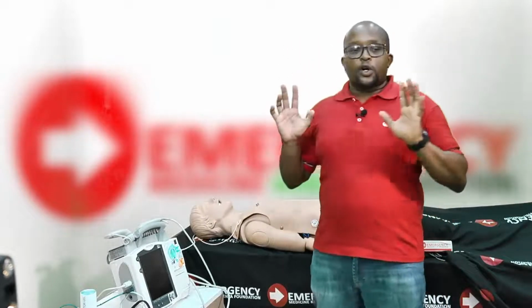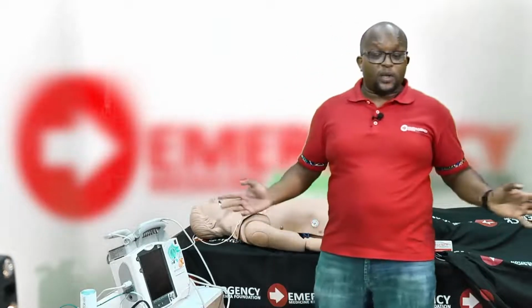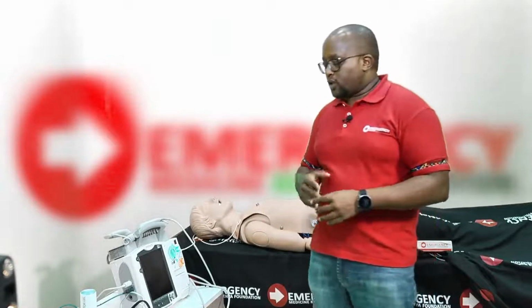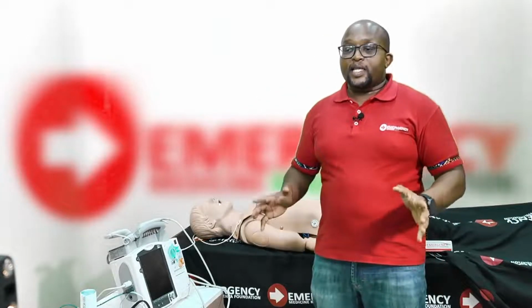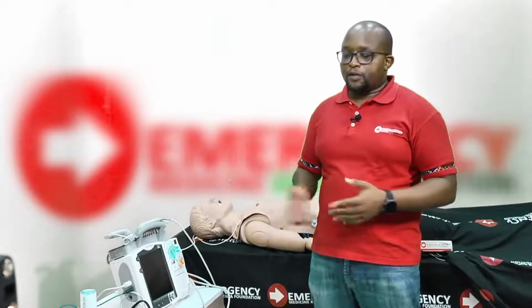All right, for you to defibrillate a patient, you need a defibrillator. There's no other plan B here. You can only shock a patient when you have a defibrillator, and so we're going to discuss how to use one. Now, I know you've potentially come across different things about monophasic versus biphasic defibrillators. The thing is, any defibrillator is good. There is no difference in outcomes whether you're using a monophasic or a biphasic.